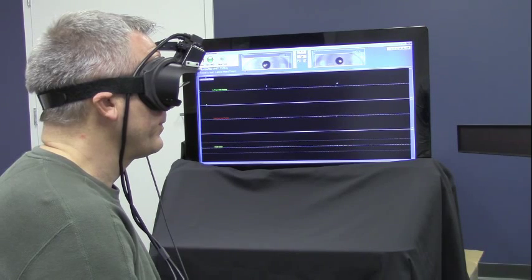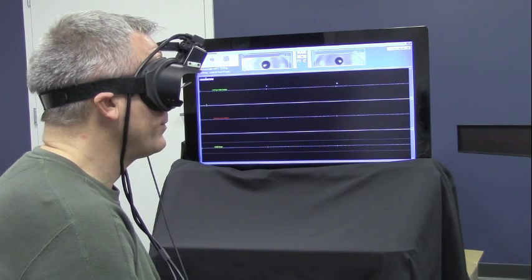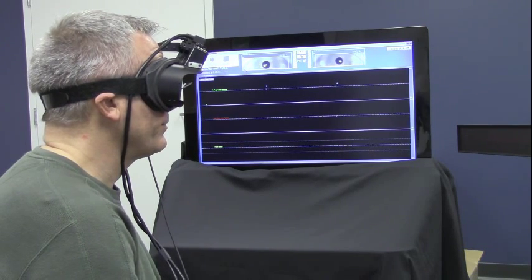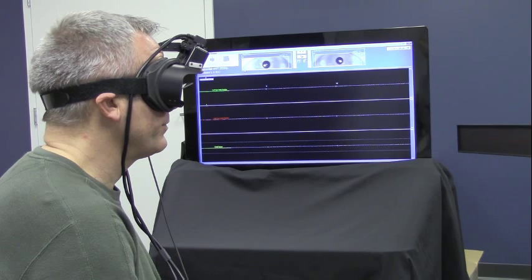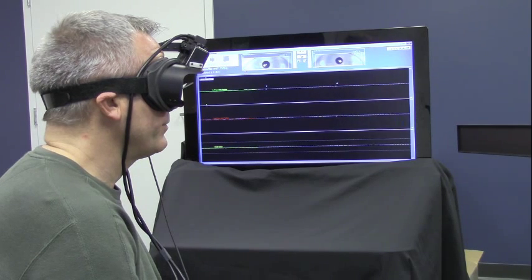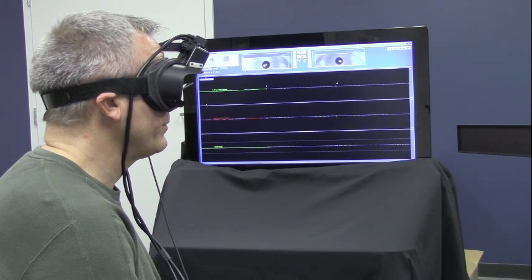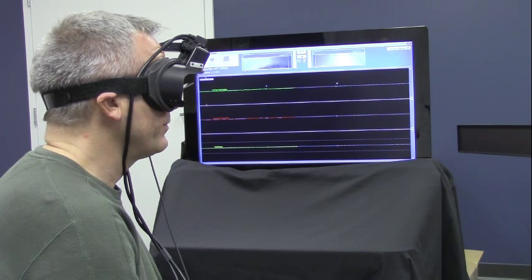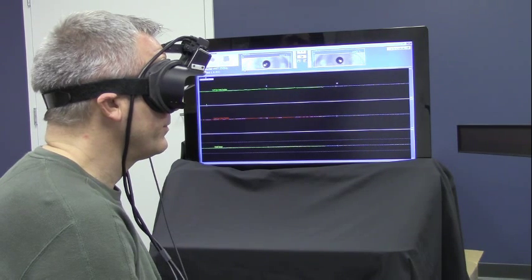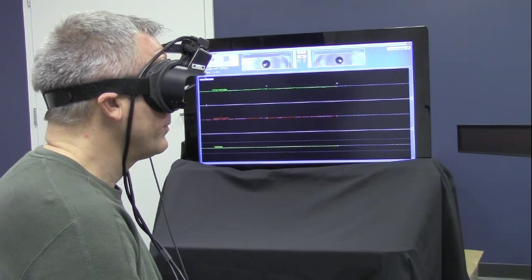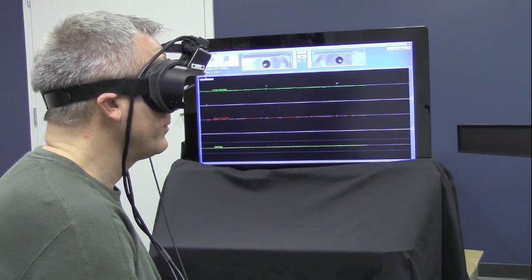When you start the recording, you have about 5 or 6 minutes to complete the test. The test requires 10 thrusts in each direction. Those are the minimum requirements, but the test will automatically stop at 30 thrusts.